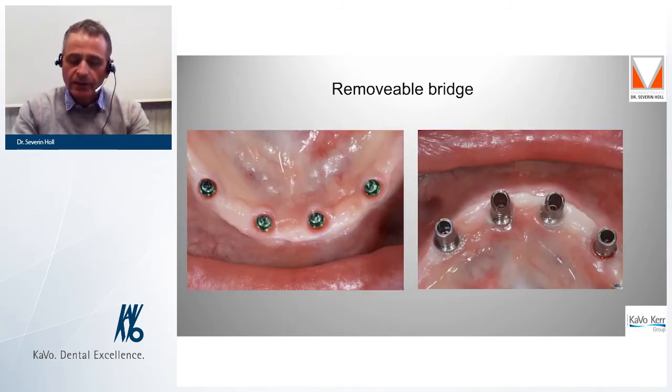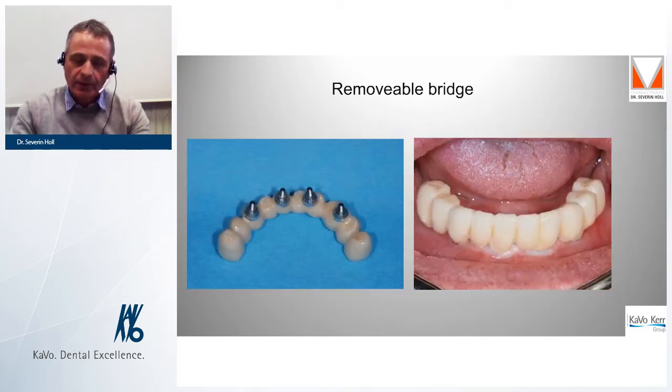On the left side, the clinical situation with 4 legacy implants, and on the right side, the fixed abutments. We glued them intraoral into the framework to guarantee a passive fit. On the left side, you can see the finished bridge and on the right side, the incorporated restoration.